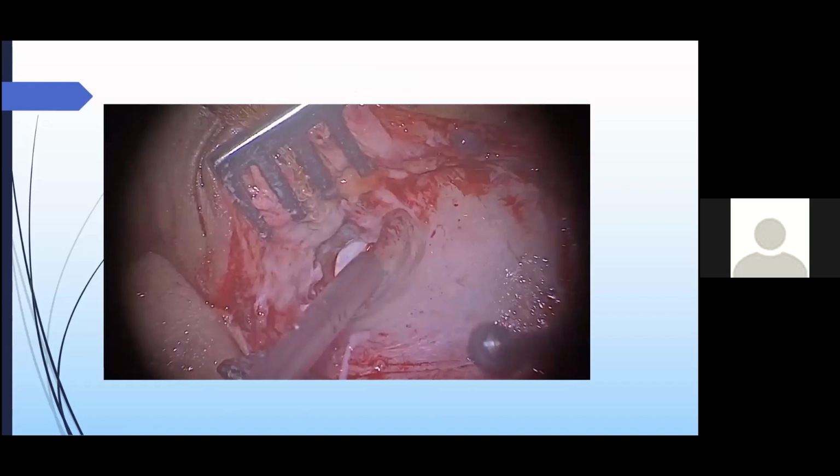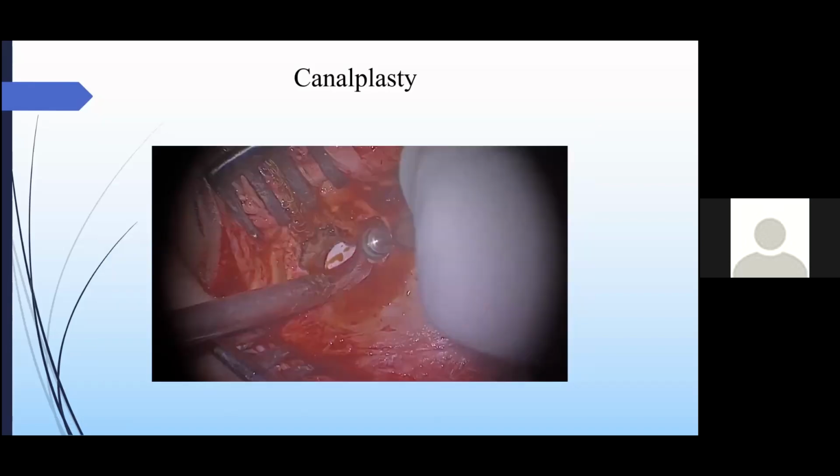One must be careful about this posterior canal wall drilling, as we can expose the mastoid air cells, and this can lead to a mastoidocutaneous fistula in the postoperative period. So in the case of a pneumatic mastoid, or even a sclerotic mastoid, if air cells get opened or communicate with the canal wall, one must not forget to close the cavity at the end of the procedure, either with fascia, periosteum, or skin, whatever suits you.